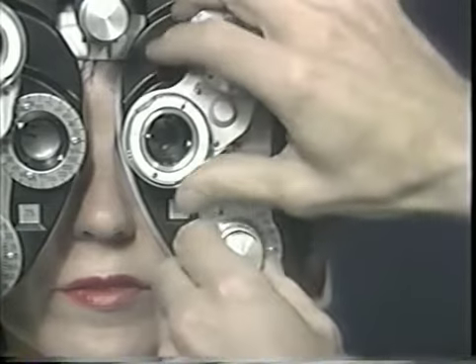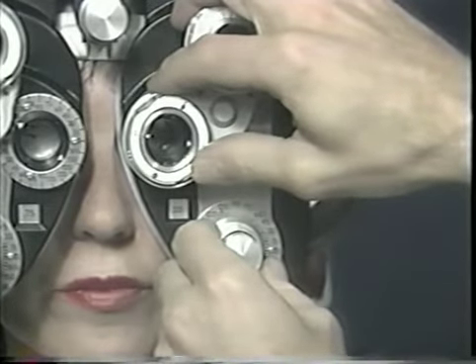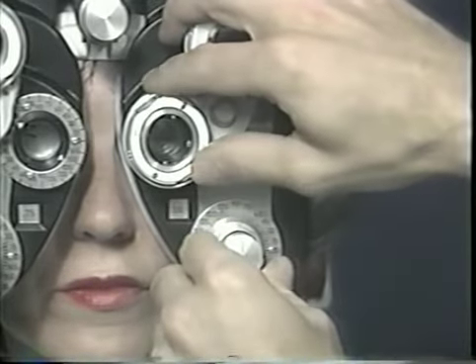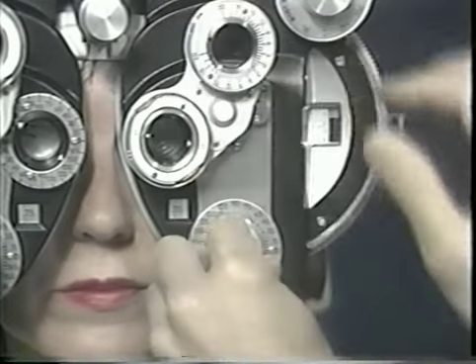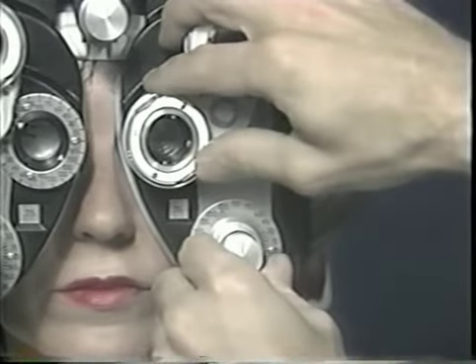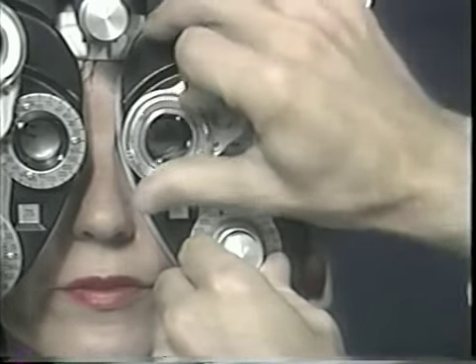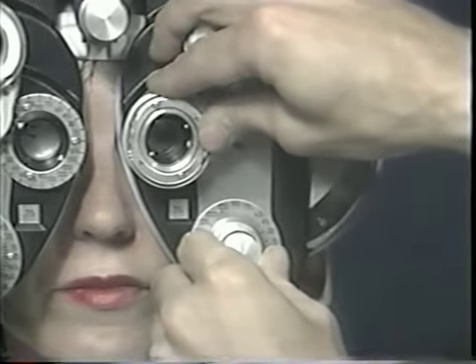Tell me which is better, number 1 or 2? 2. Good. Okay, 3 or 4, or about the same? 4. Okay, 5 or 6, or about the same? About the same. Good. Now, 3 or 4? 3.